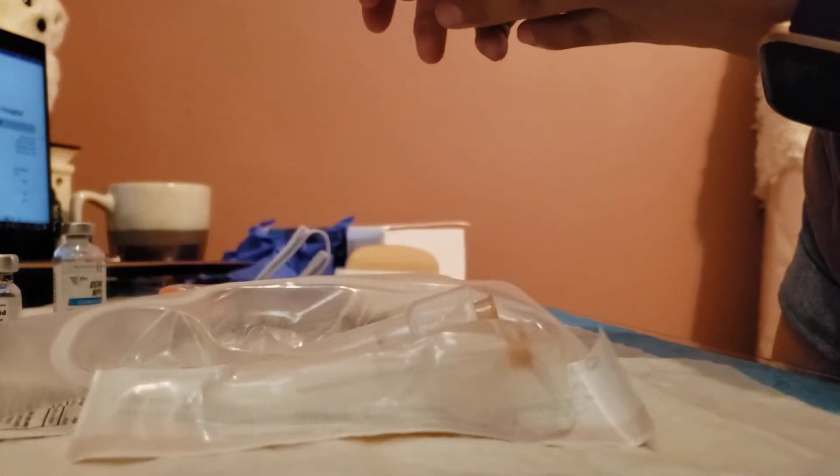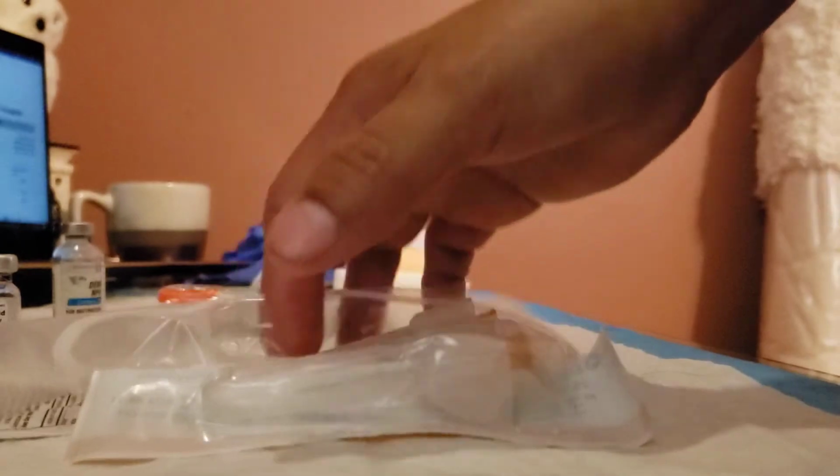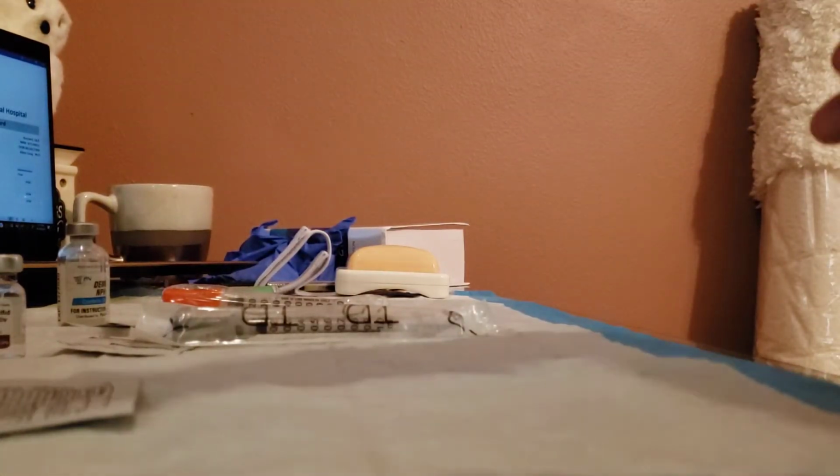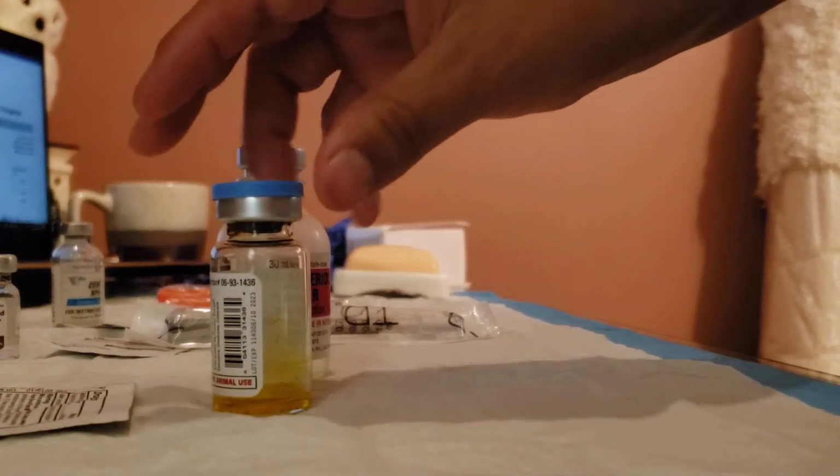Let me make sure I'm filming everything. Wow, you can't see anything. Okay. So I'm going to start with my antibiotic here. For some reason in my kit, I only got one of these, and so we're going to pretend that this is just powder.